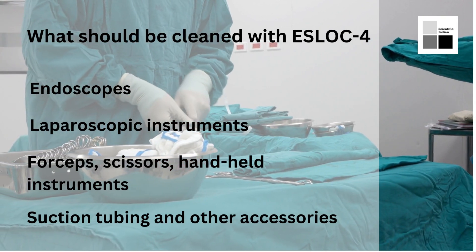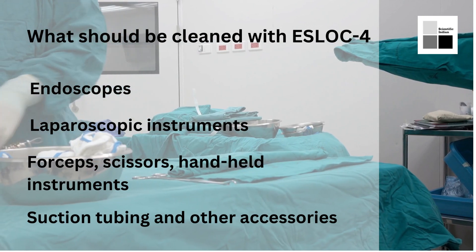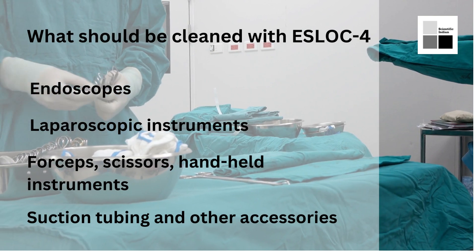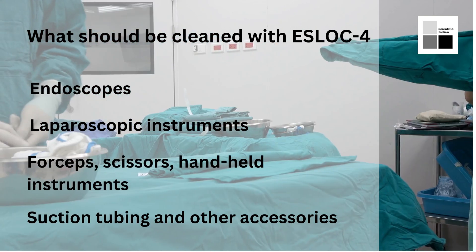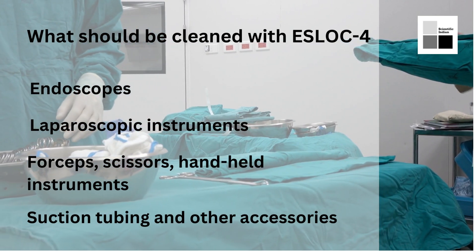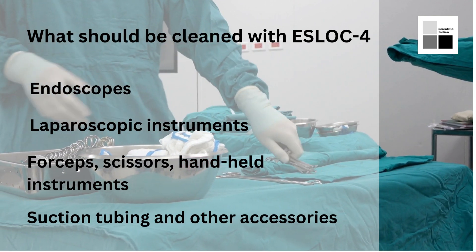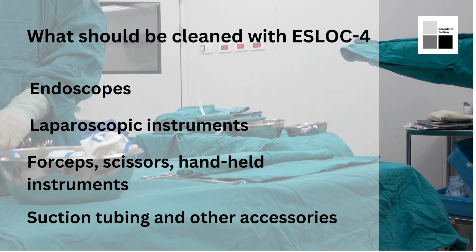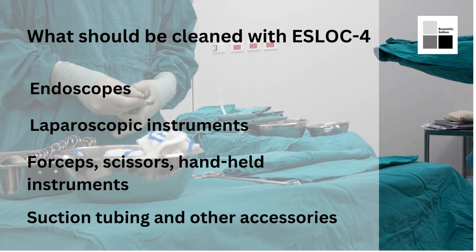The second type of instruments are laparoscopic instruments. These are used in surgical procedures and have complex geometries that can be very difficult to clean, as instrument cleaning tools like brushes cannot reach those complex geometries. SLOC4 multi-enzyme cleaners are effective in cleaning these instruments because they can reach tight spaces and crevices and remove organic debris from there.